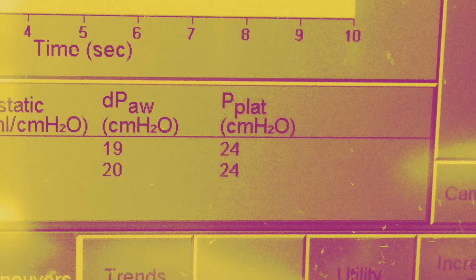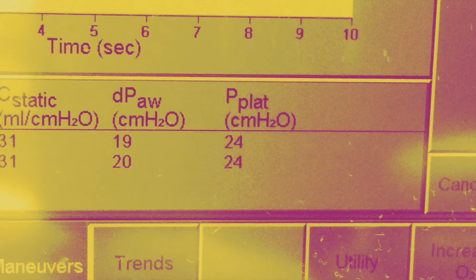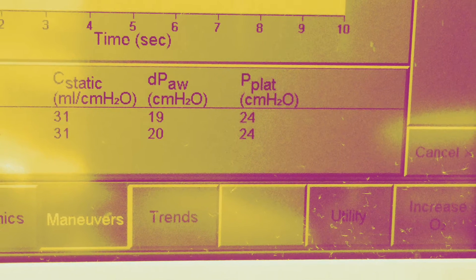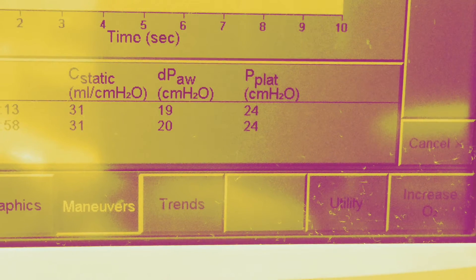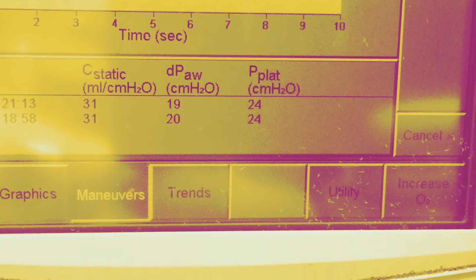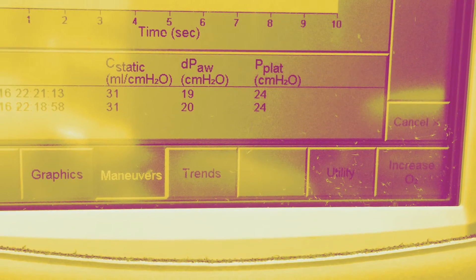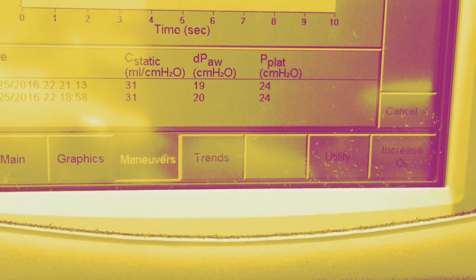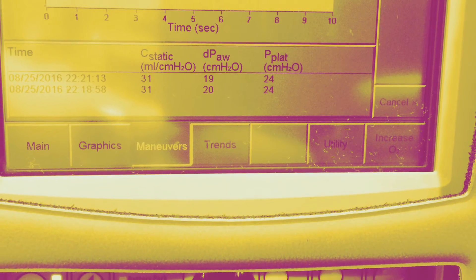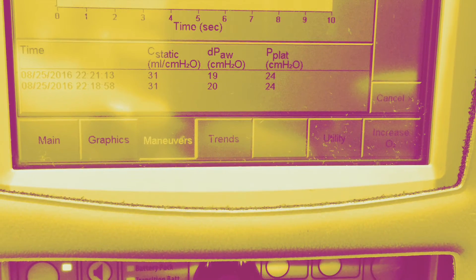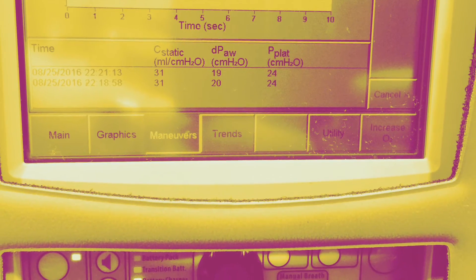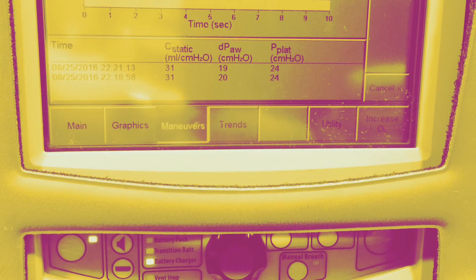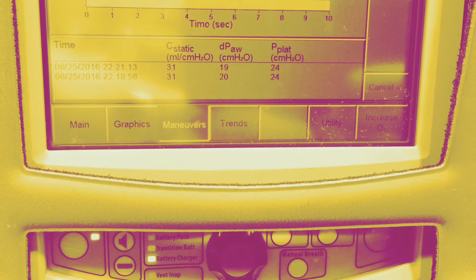Hey guys, welcome to another Lifestar EMS training video. This is our second video in the NV ventilator series. Today we're going to be talking about plateau pressures, or P-plat pressures as they're displayed on this vent. We're going to talk about what they are, how to check one, and how it might actually change your treatment or settings on the patient.